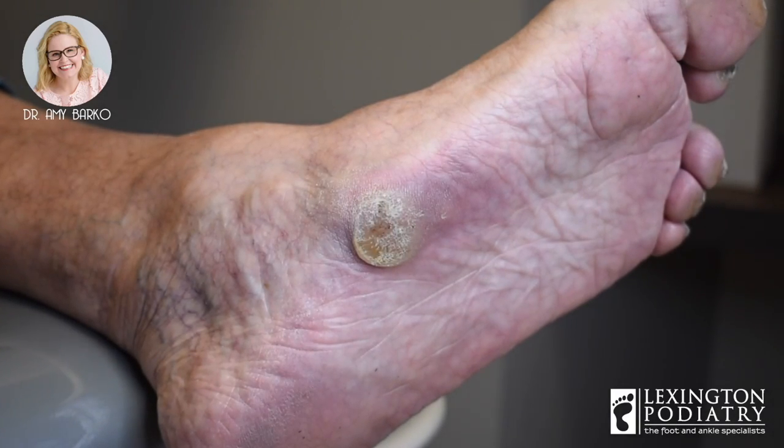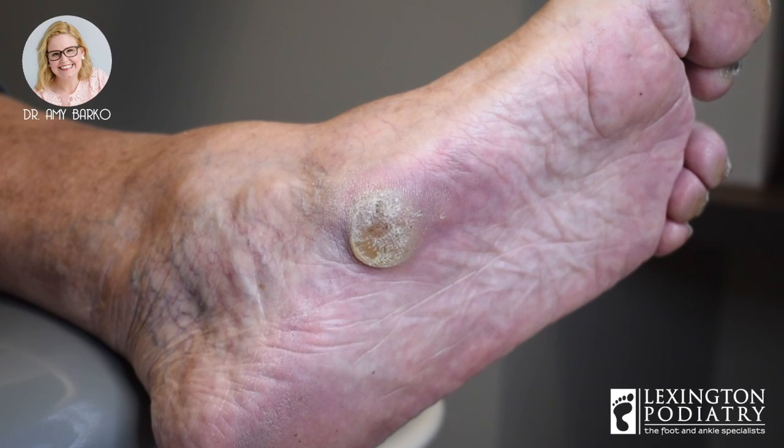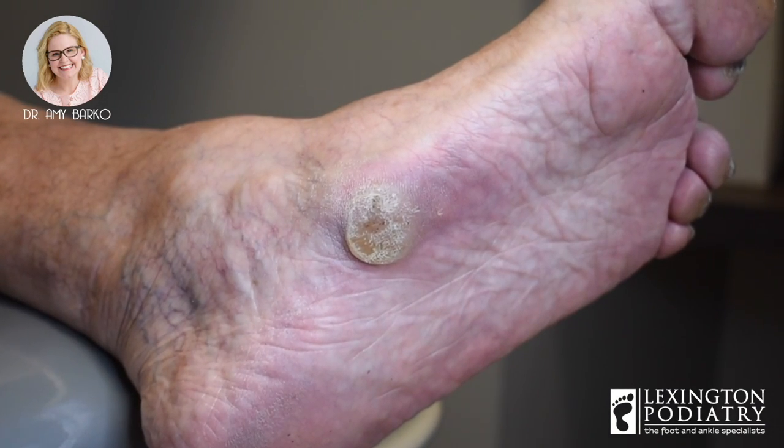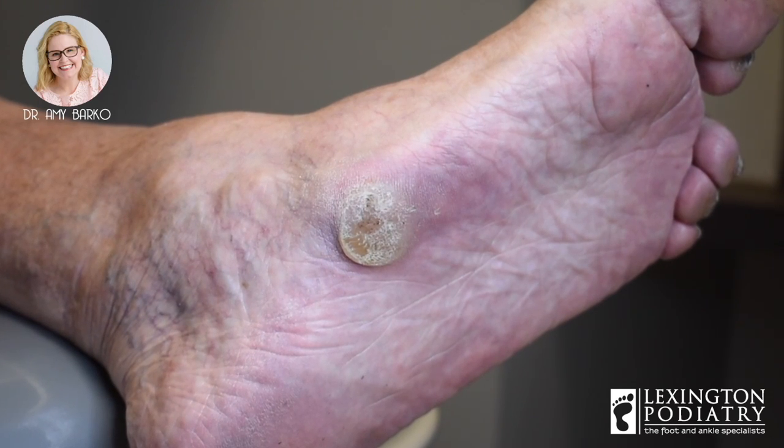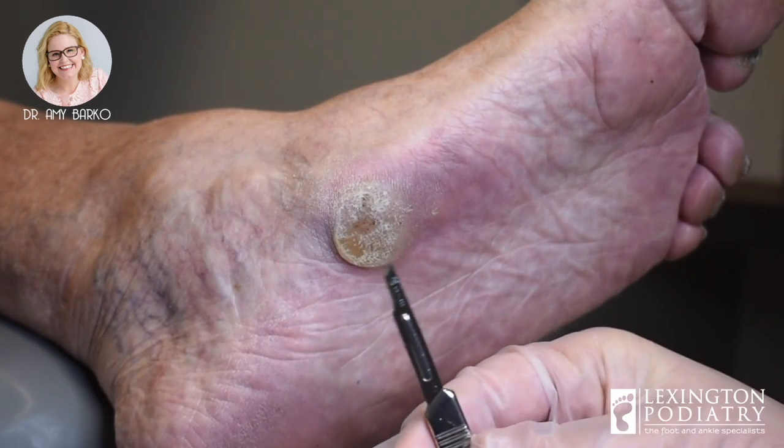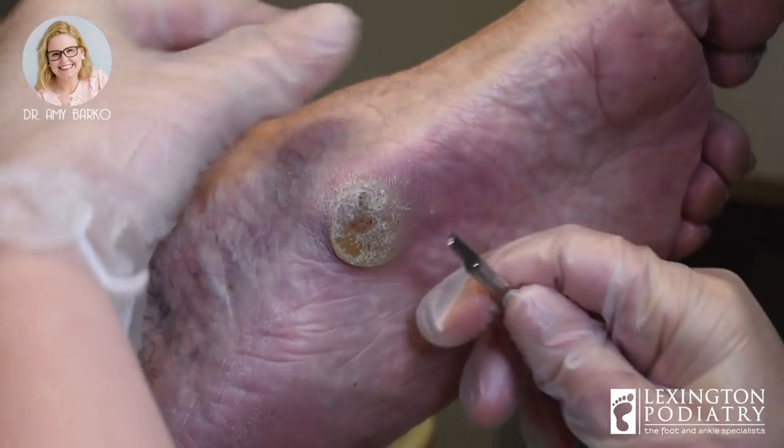We may show you her other foot here — it's not as severe, but you can see it. So we've got a blade handle with a number 15 blade today. This is a scalpel. You can use all different sizes — this is my choice, this is what I like.